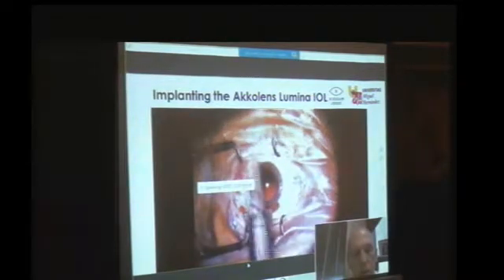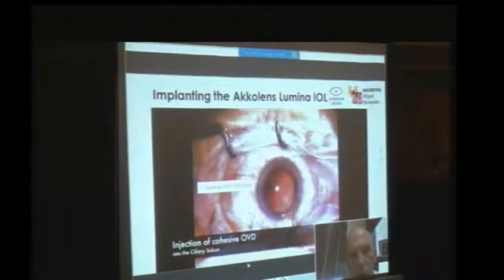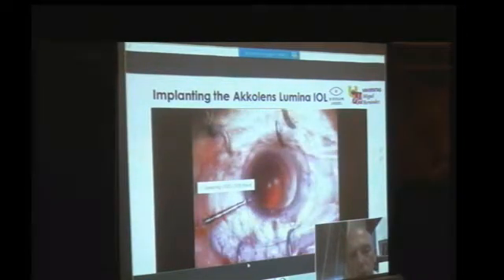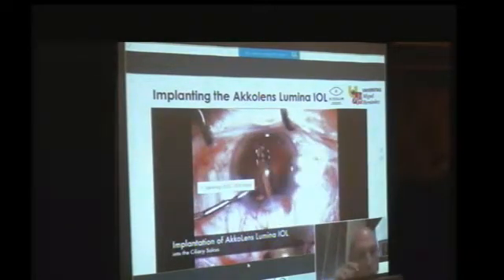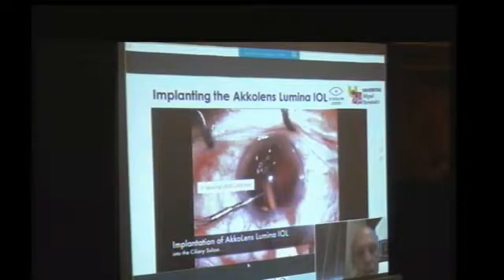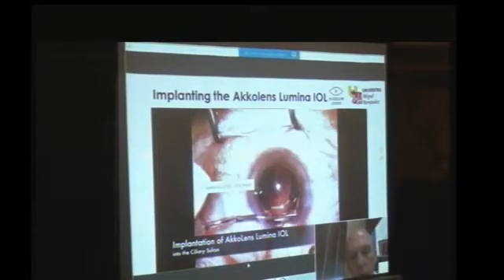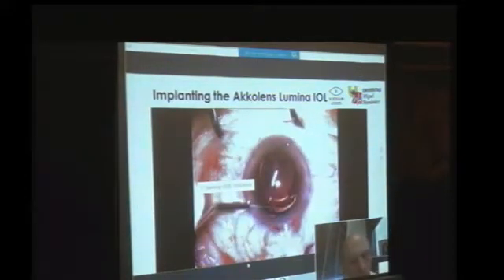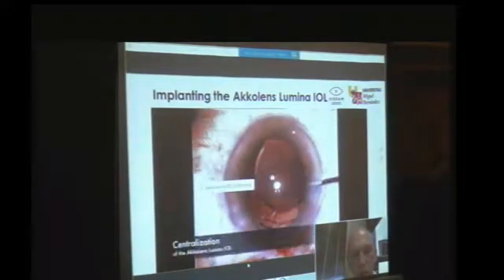To make this implantation, we use more viscoelastic to further collapse the anterior capsule onto the posterior one, and then we are introducing, as you will see, the tip of the cartridge down to the 6 o'clock hours. We inject the lens, taking care that the lens is in the sulcus, and with the second instrument we force the trailing haptic to be behind the iris, not trapping the capsular bag. So this is the lens, which is located just at the sulcus.